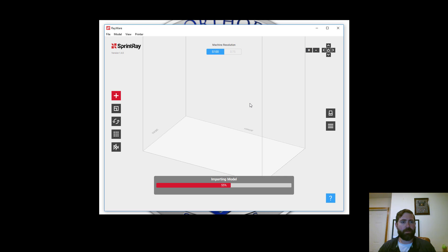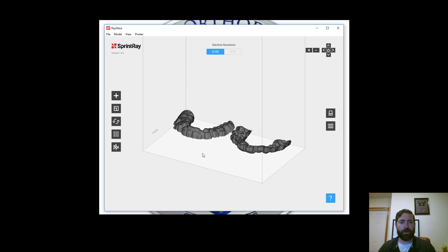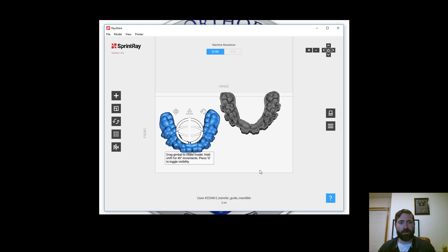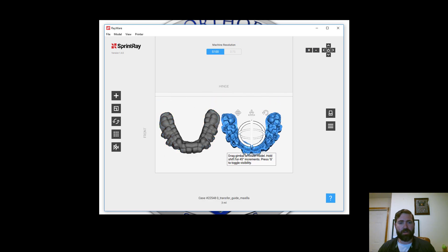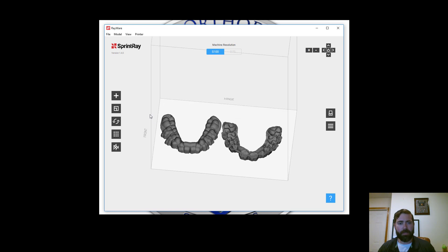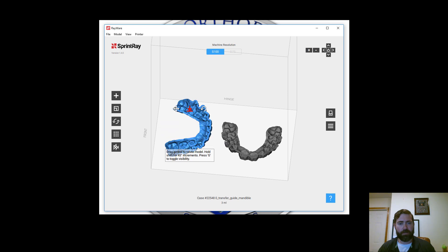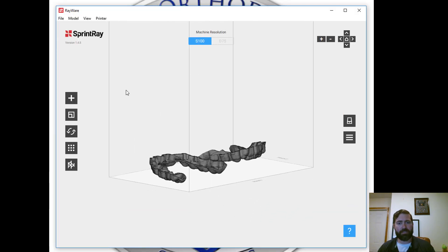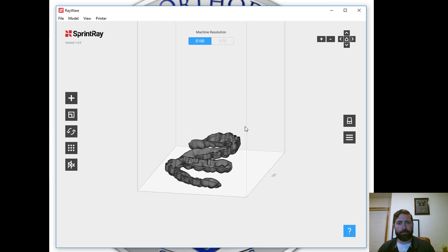I have SprintRay open with the Rayware software here, and here are the trays. Now it's going to be printing from the bottom, so I will want to flip this around. I will make some support guides off of these — it doesn't have to be perfect by any means because we're just printing them.